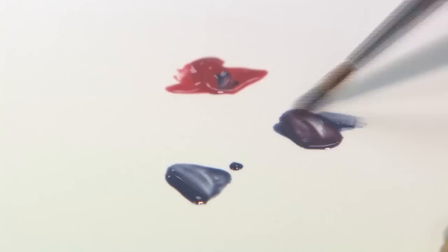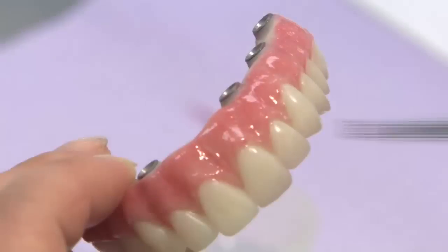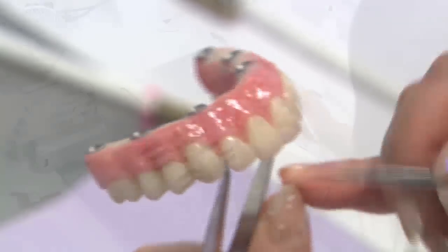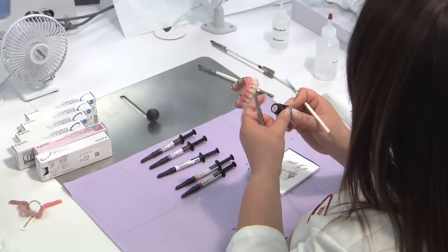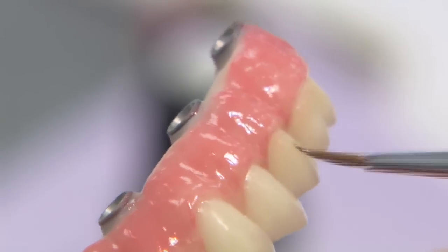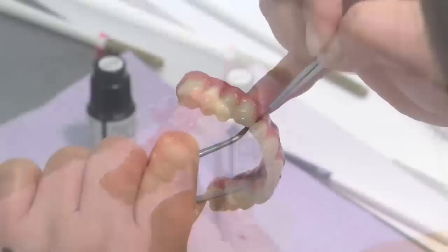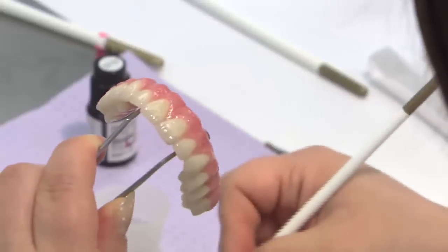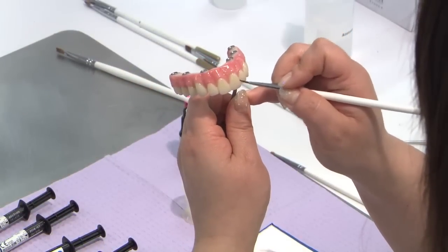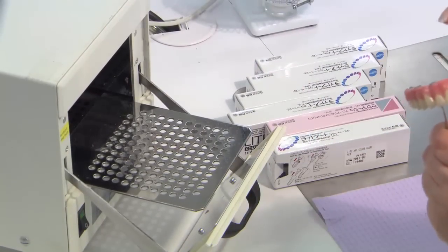Here, pink and blue-gray were mixed to create the incisal violet stain. Be sure to correct any errors before curing the PMMA appliance. Once the appliance is ready, it will be cured again for 20 seconds, or for the length of time your equipment specifies.